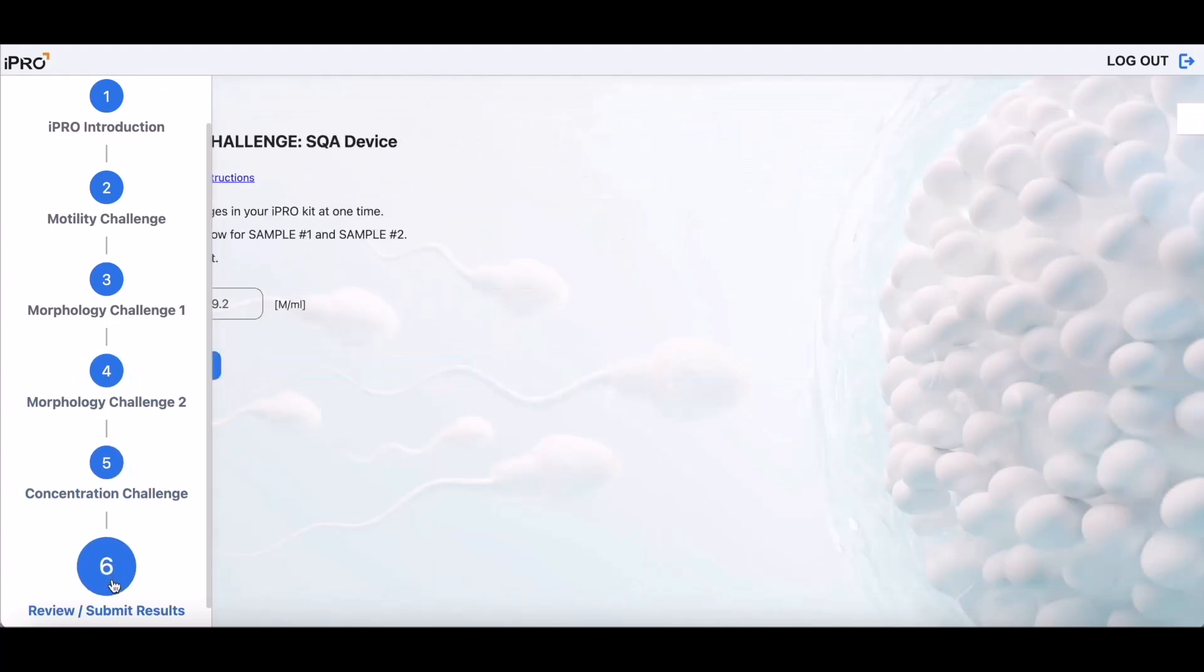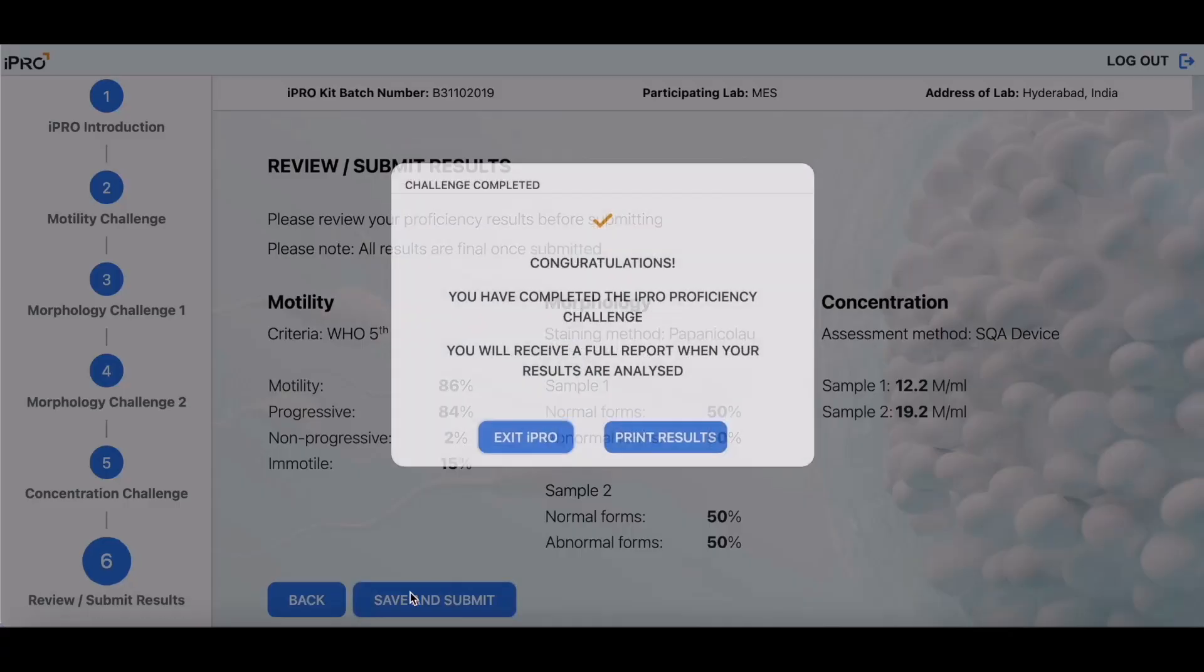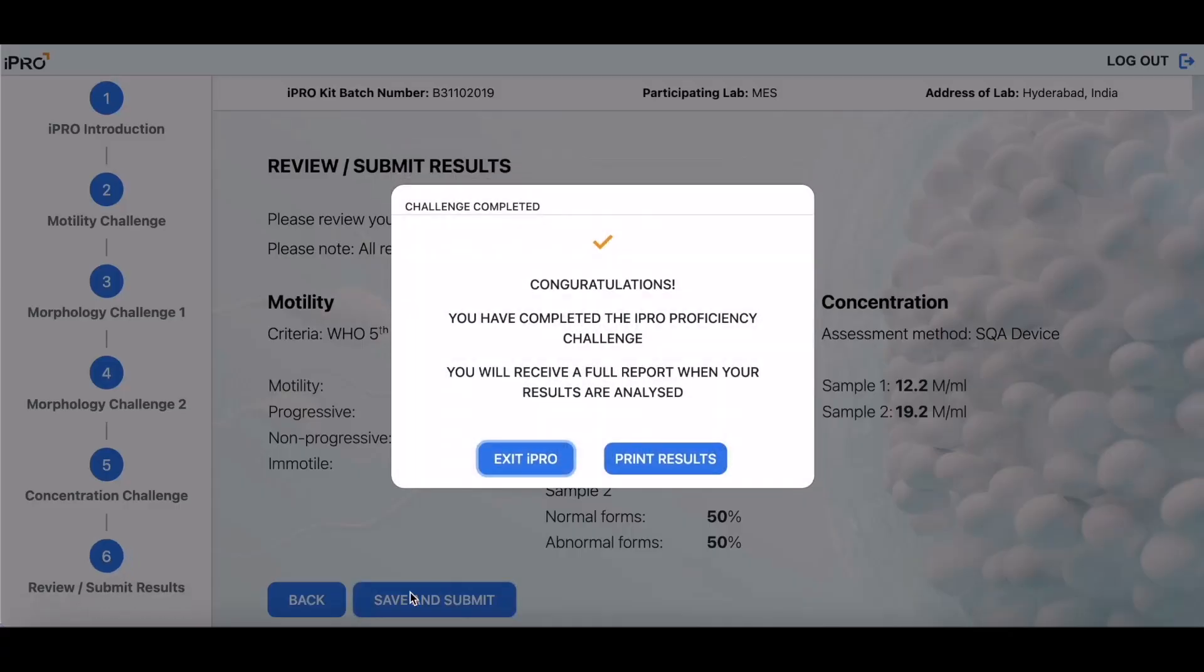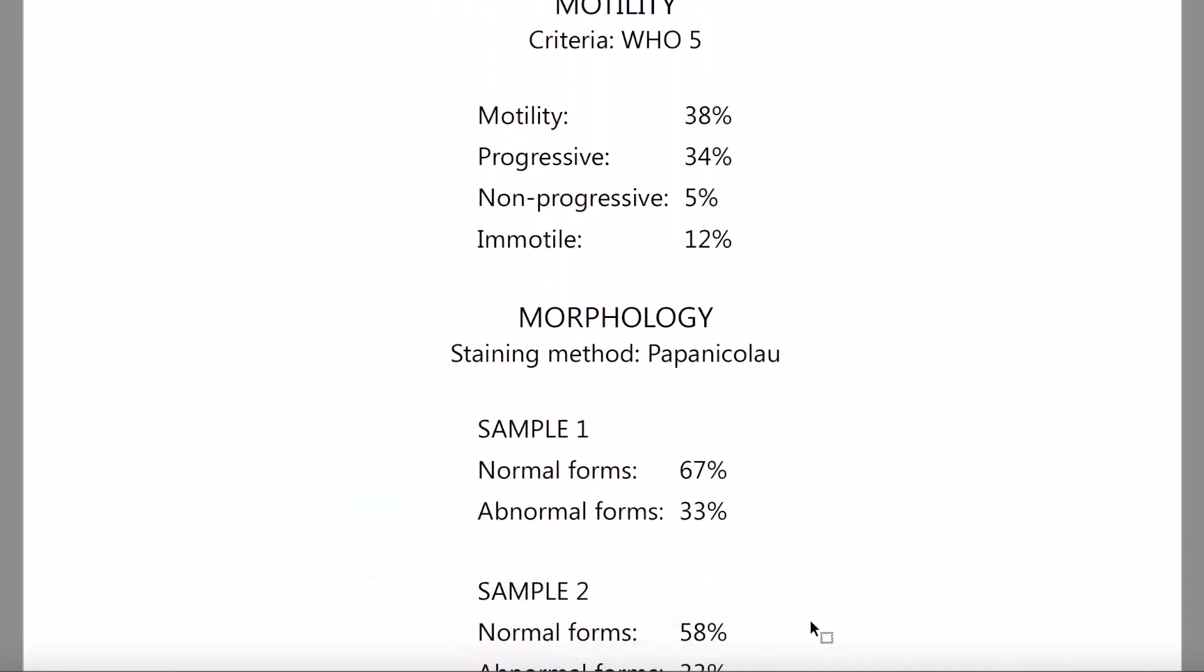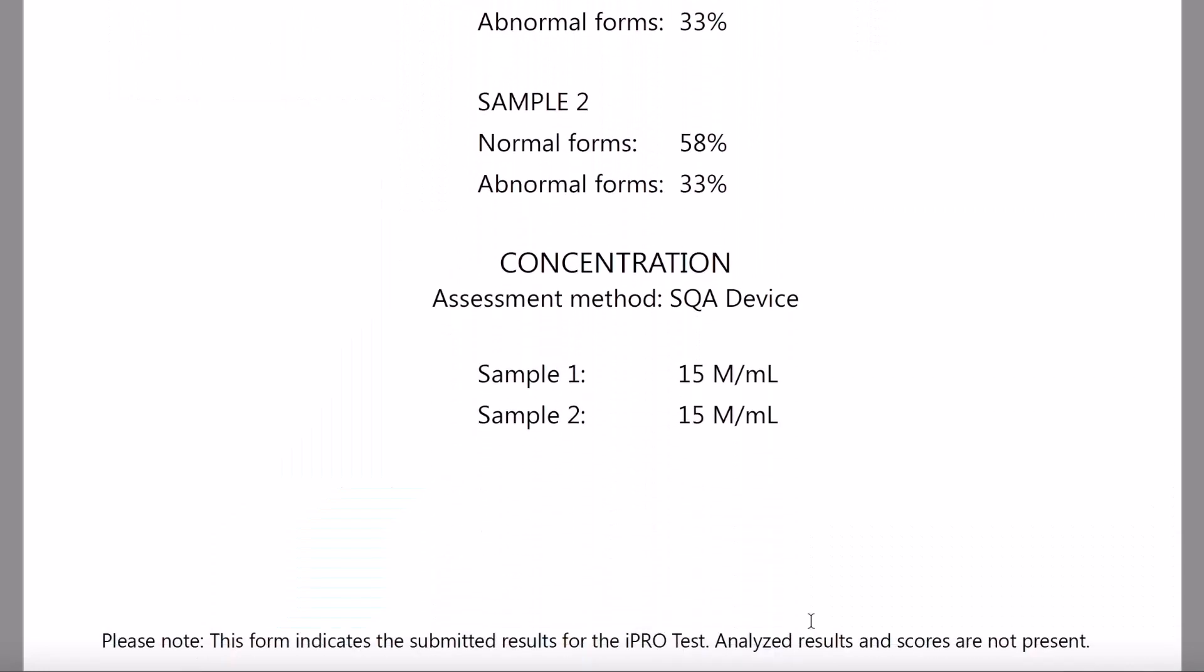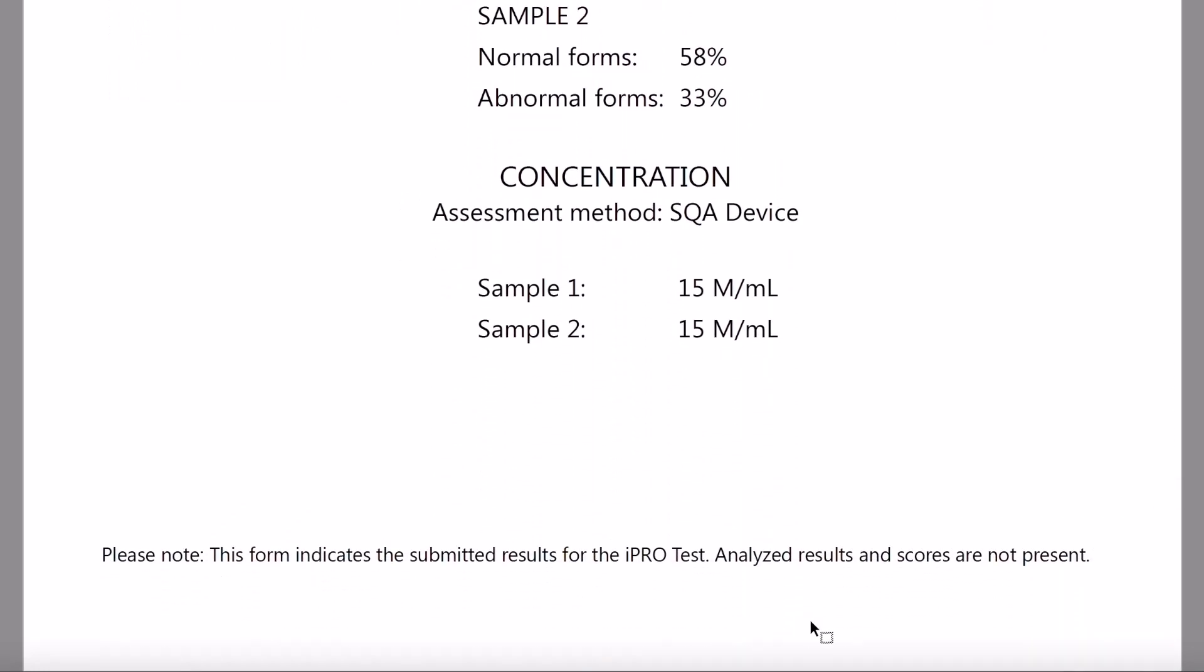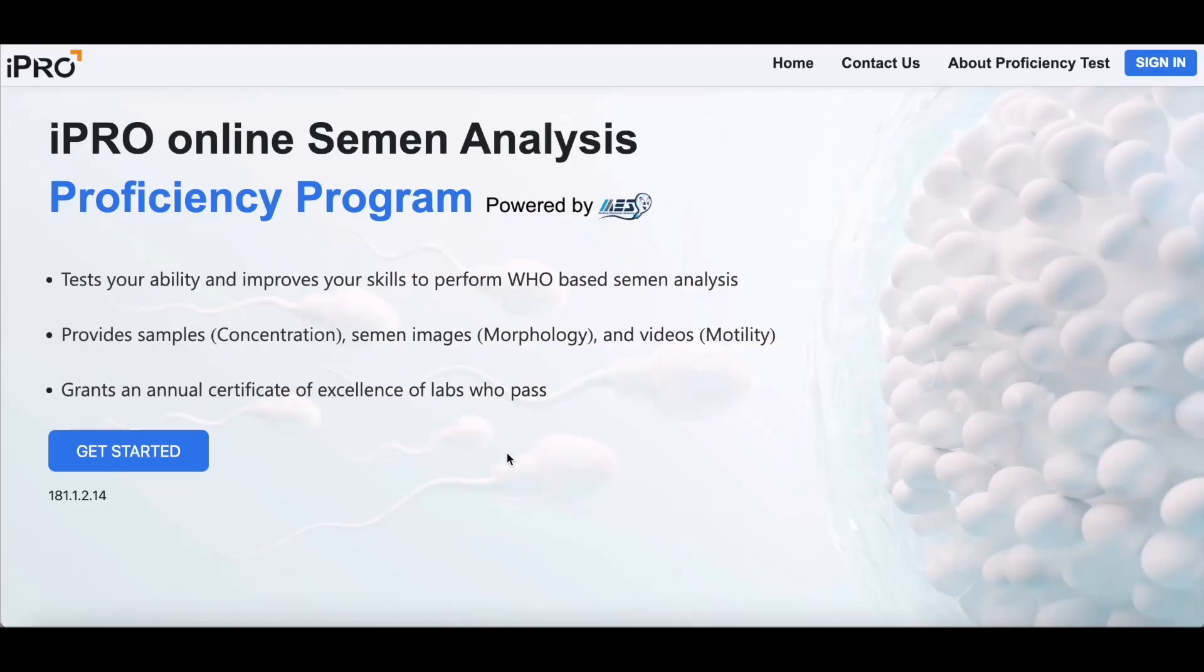Review your results and then save and submit them for iPRO analysis. Keep a copy of your results and confirm submission by clicking on Print Results. Click Exit iPRO when you're all done. Thank you for choosing iPRO for your proficiency challenge.